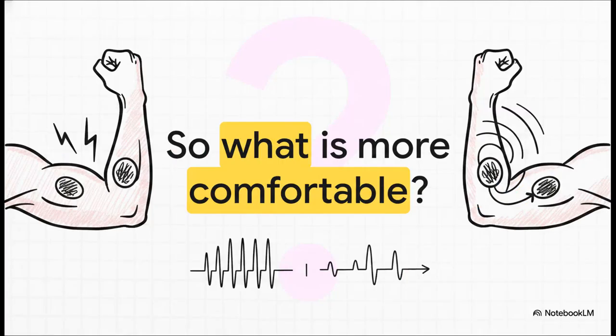So before we even think about touching any equipment, or even seeing our patient really, we have to ask an absolutely crucial question about the patient's experience. You see, Faradic current involves stimulating nerves to force a muscle contraction. And honestly, that can feel pretty intense. So how do we make it comfortable? Well, it all comes down to pulse width modulation, which is just how long the current is actually flowing, and duty cycles. Manipulating those factors completely changes how the electricity feels on the skin.